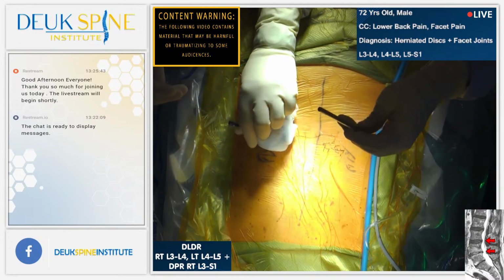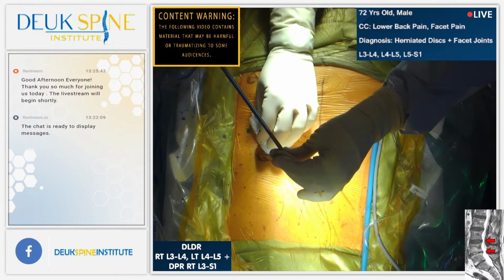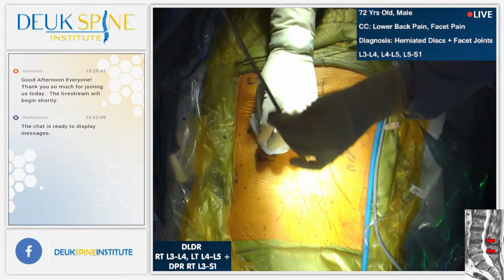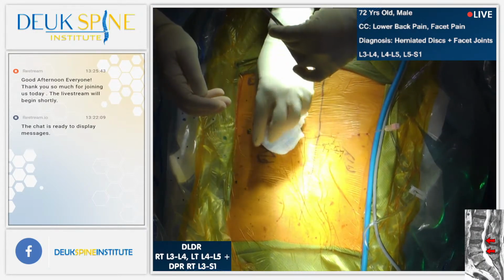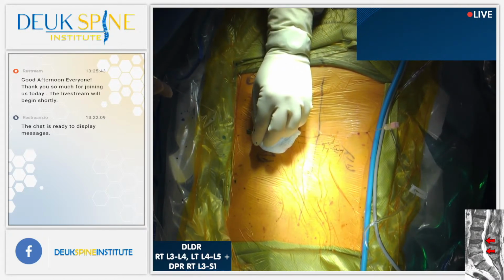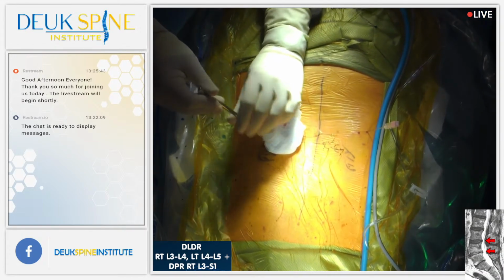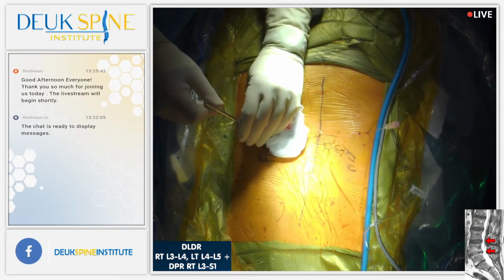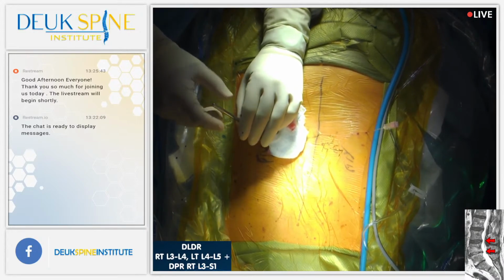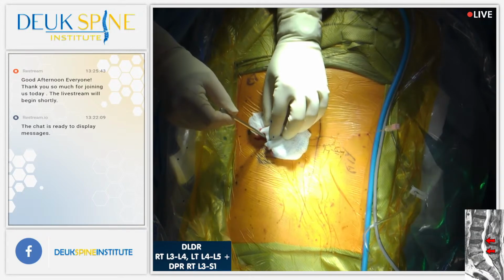Yeah, we don't have patients watch their actual surgery. I know that some places do that. But we want our patients asleep for the painful parts. Keep counting out loud. Is he asleep? All right, so he's asleep at this point.